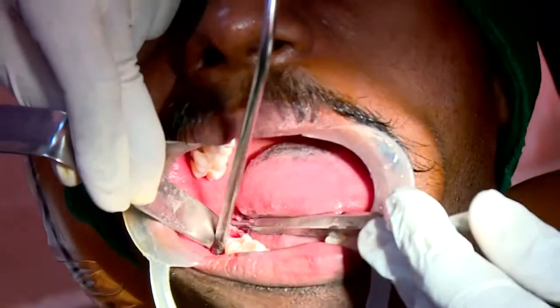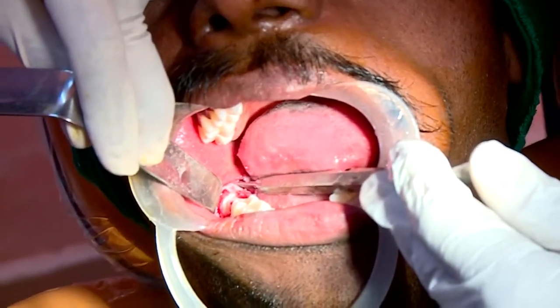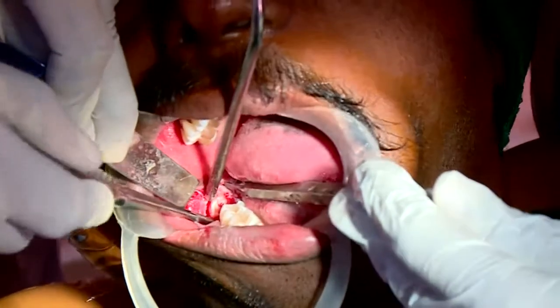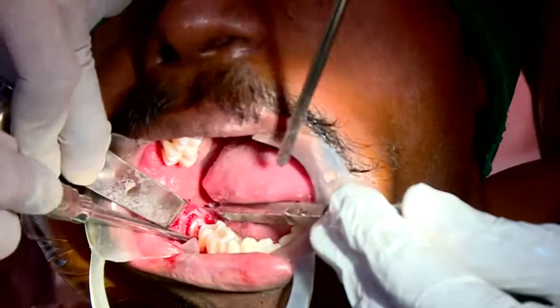Like I said, this is a class 2 case. There is a greater amount of bone that you have to remove. In the classification, class 2 is where half the tooth will be inside the ramus of the mandible.